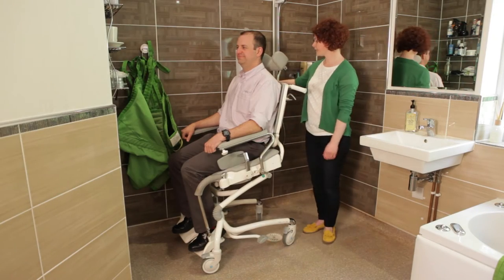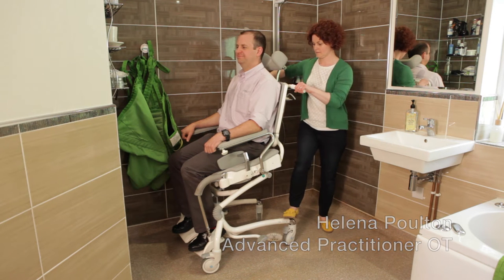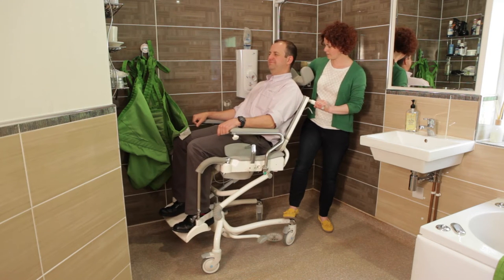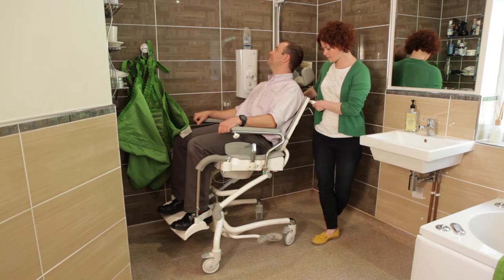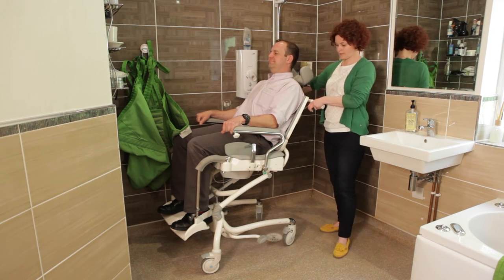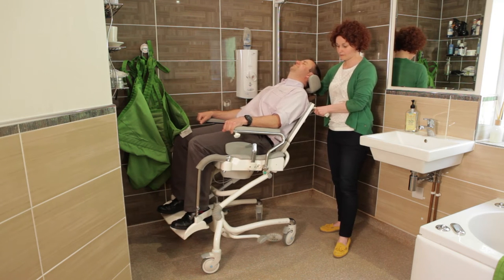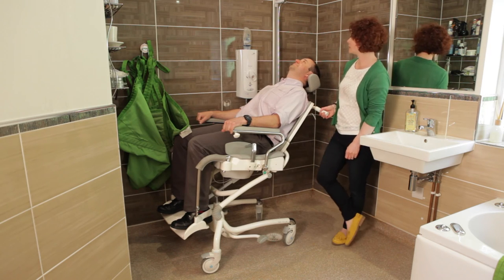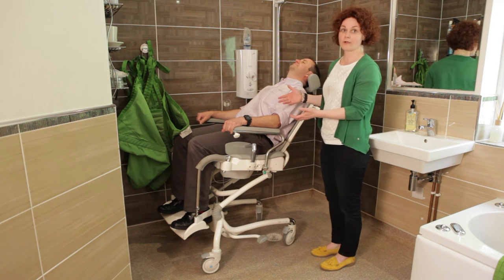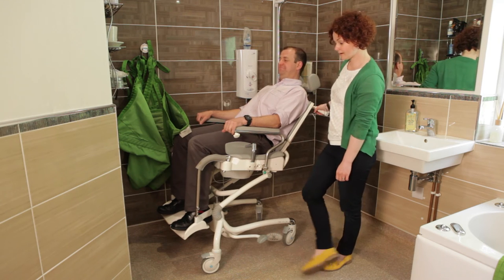So first off, we can now tilt Gareth back in space, so we get him in position so that he can be under the shower head and operate the controls if he needed to. And then we've got the added option of now being able to use recline or opening of his hip angle to actually let him relax a little bit more under the shower itself. So this means now from a carer's perspective, he's at a more appropriate height for me to assist him, and he feels comfortable and safe to be able to be showered effectively.